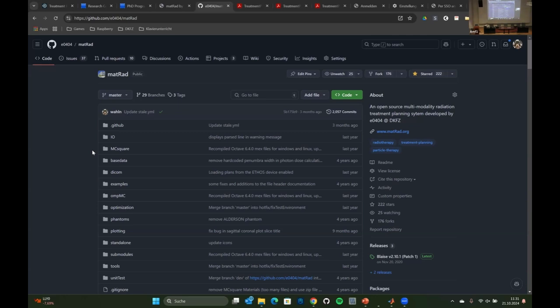Maybe the program will not run because there is some incompatibility on your system. Maybe it will break at some point. So it is unlikely that we can resolve these questions here. If I try to do this while presenting, I will sit here for 15 minutes trying with individual people to get it running. So this doesn't make sense.